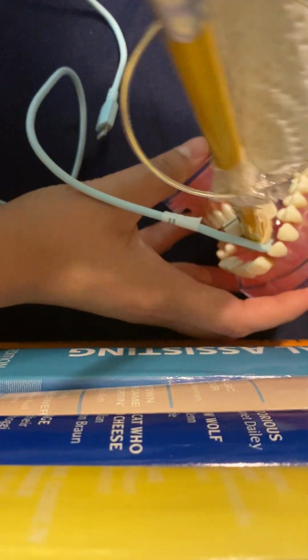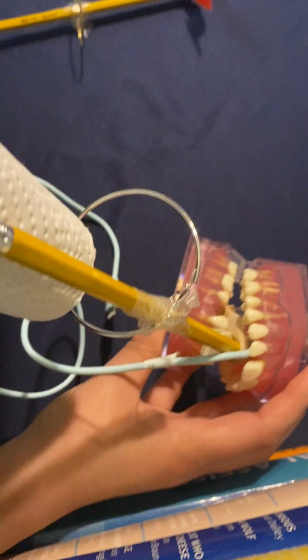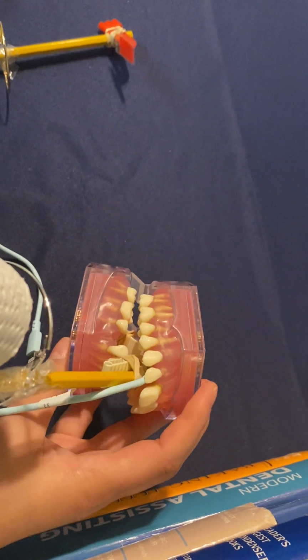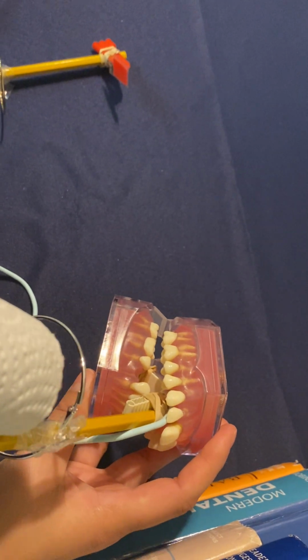See if I can get it in there so you can see. Very much so. Like that.